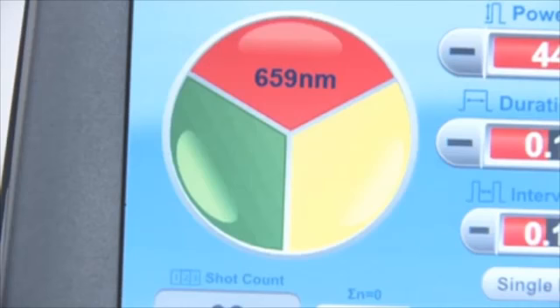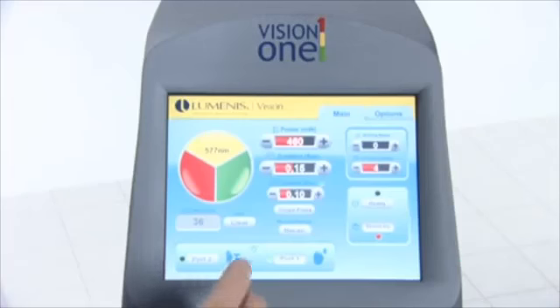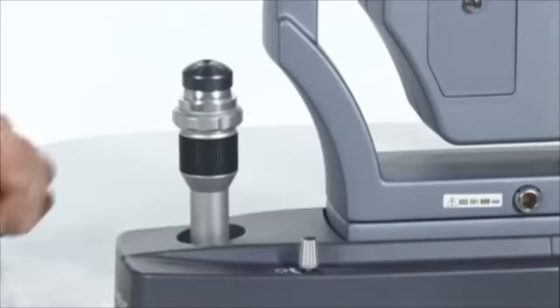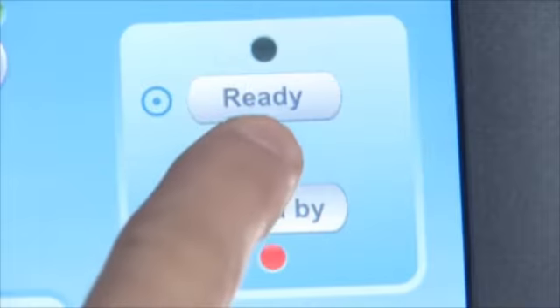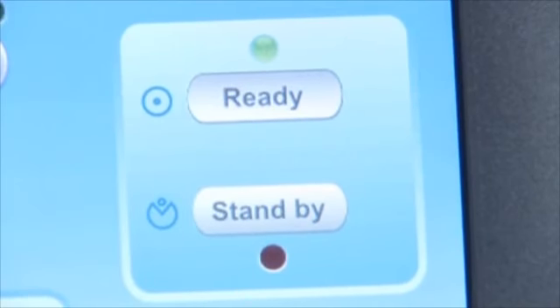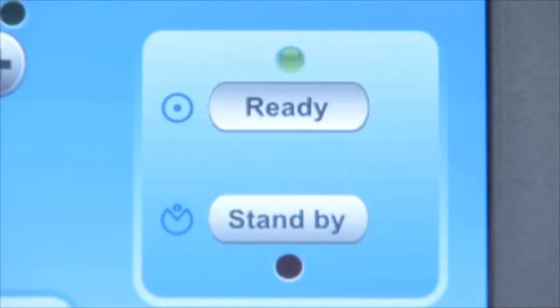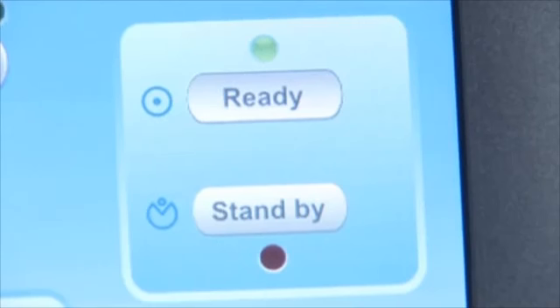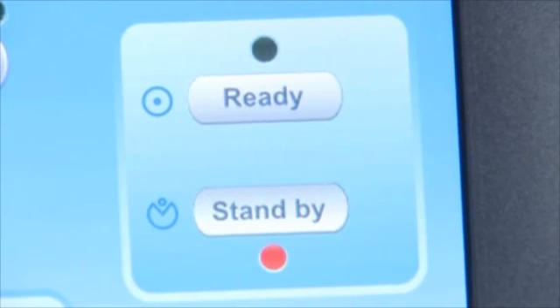After establishing correct parameters, select the laser color and set the treatment parameters as instructed in the Setting Treatment Parameters in this presentation. Then, position the aiming beam on the target tissue and place the laser in ready mode. Depress the foot switch to deliver the treatment beam. During treatment, Treat displays on the control screen and illuminates on the remote control. If surgery is interrupted, place the laser in standby mode to disable the foot switch.